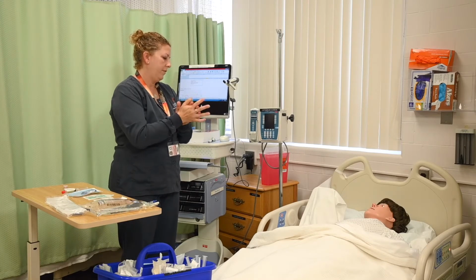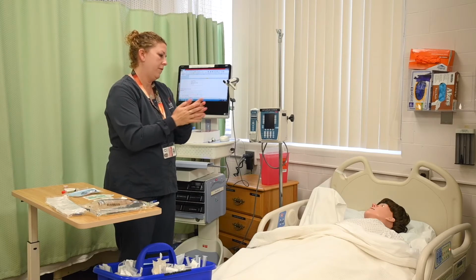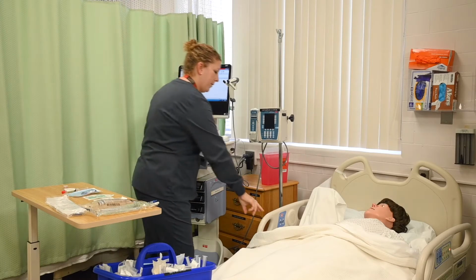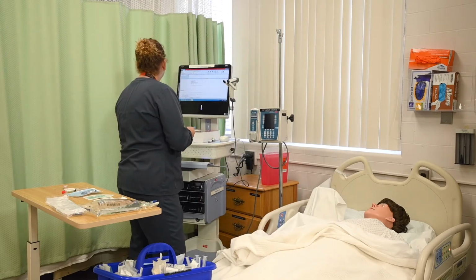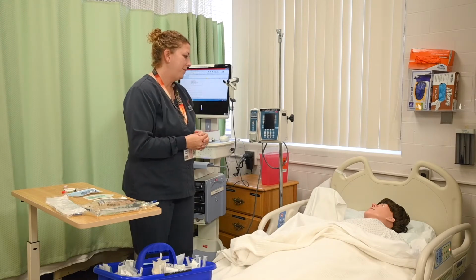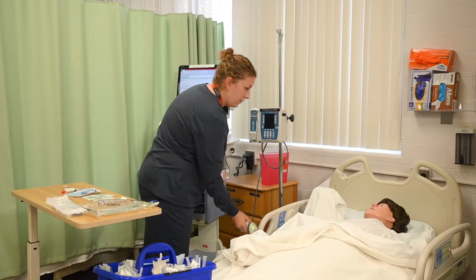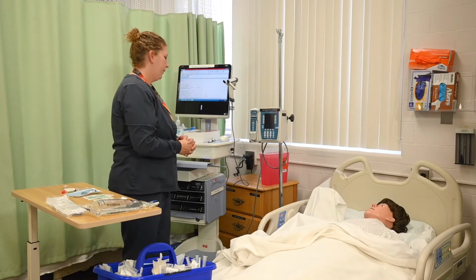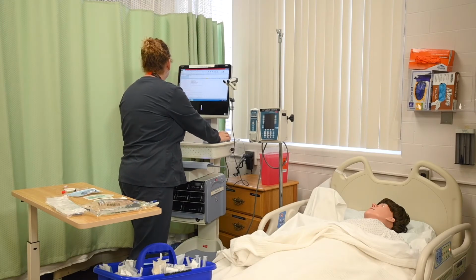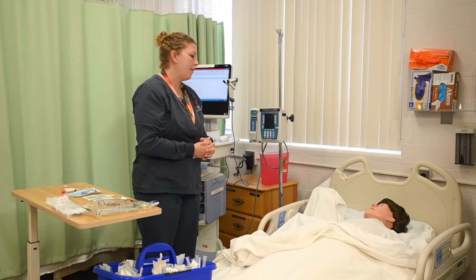Identify the patient using 2 patient identifiers such as patient name, date of birth, medical record number, and compare to the patient's MAR. Can you tell me your name and date of birth? Good. Scan the patient. Again, verify patient allergies. Can you tell me if you have any allergies? Okay, that won't affect our procedure today.